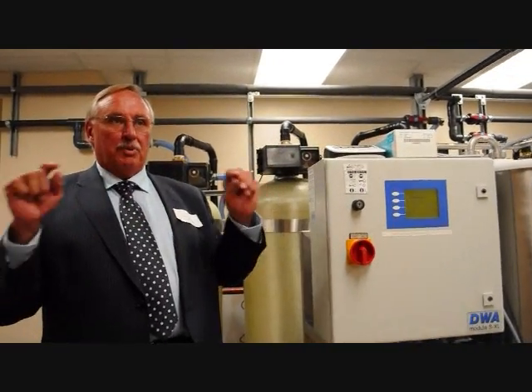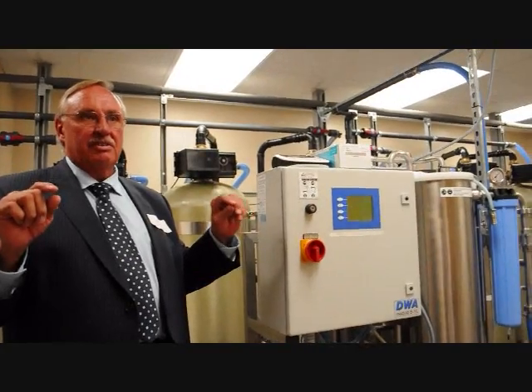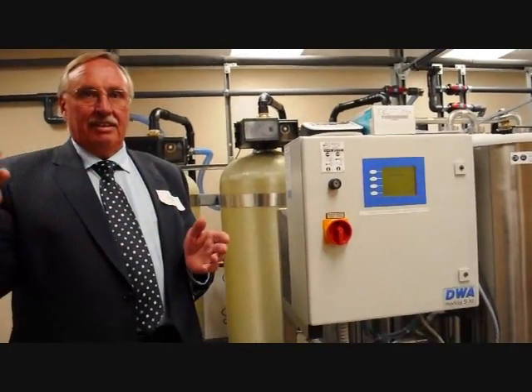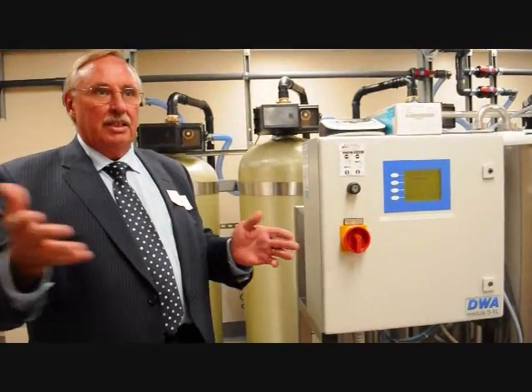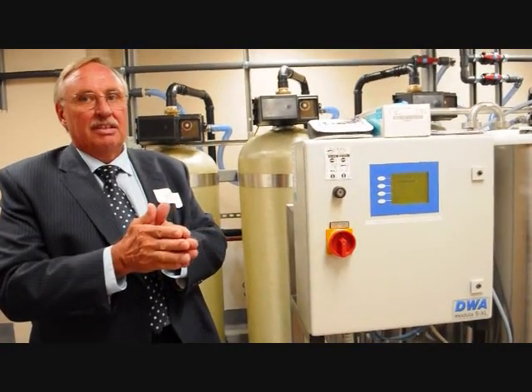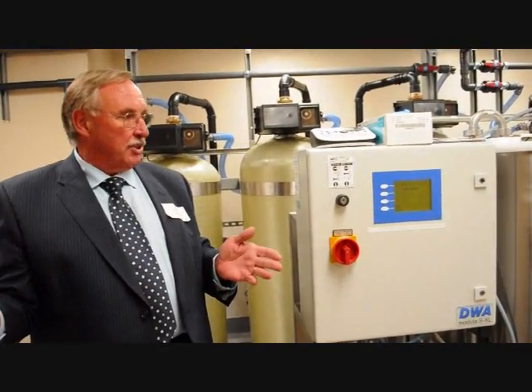Water is the central part of dialysis. Water is required for dialysis. If you can't supply water, you can't do dialysis, because water is a platform that is used to build the prescription that the doctor writes so that it can be transferred between the water medium and your blood as the two pass in the membrane, which is the kidney dialysis machine.